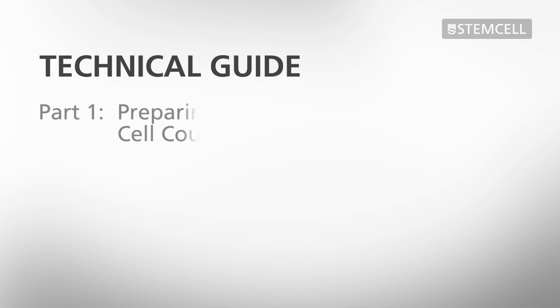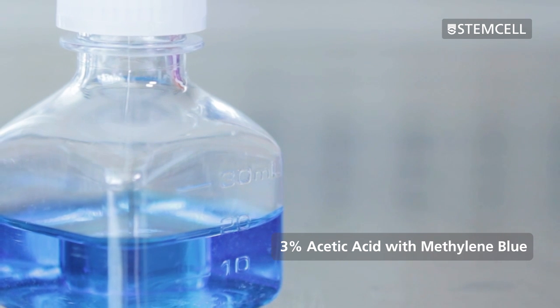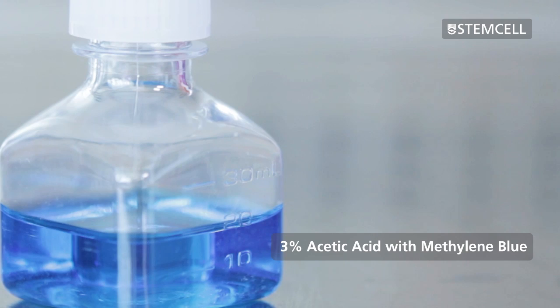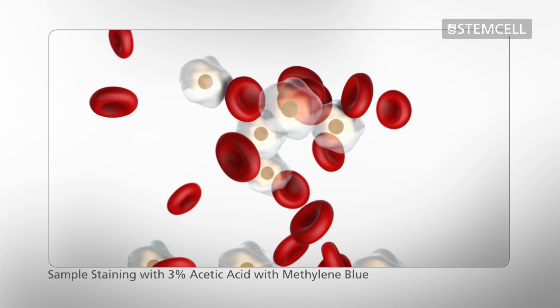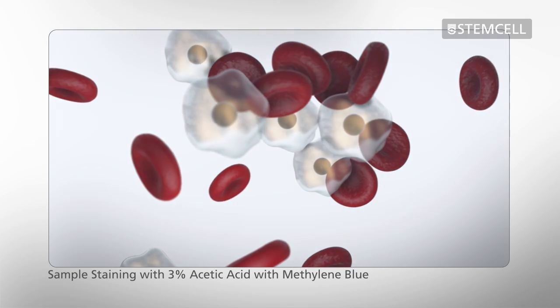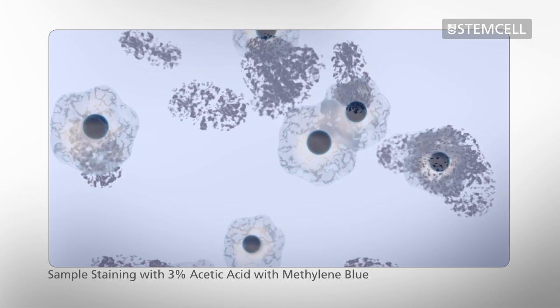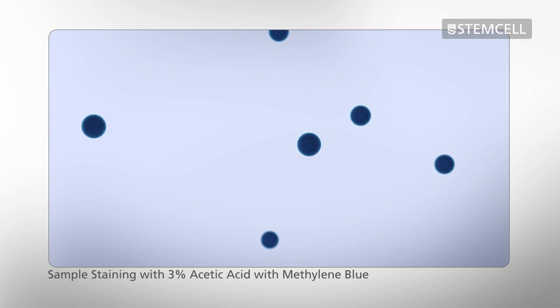First, we will demonstrate how to prepare samples for a total nucleated cell count. 3% acetic acid with methylene blue is used to identify nucleated cells. The acetic acid lyses the cellular membranes to expose the nuclei, which are then stained with methylene blue and can be easily identified under the microscope. Because mature red blood cells do not have nuclei, they are excluded from this count.